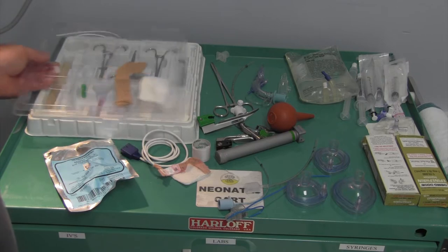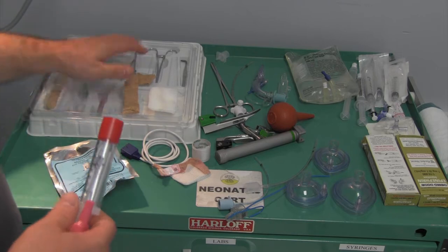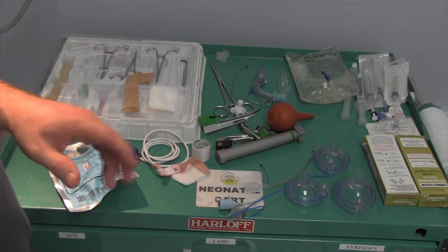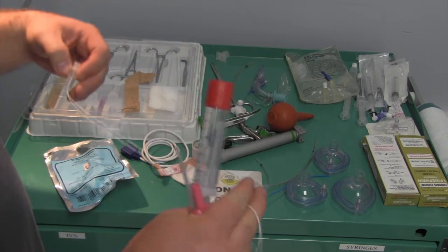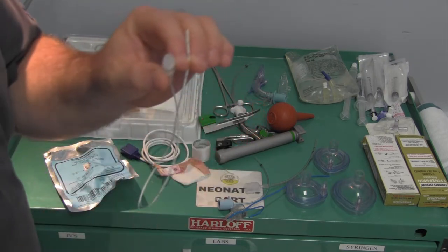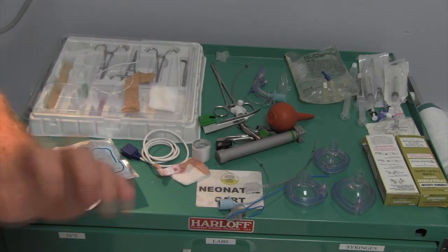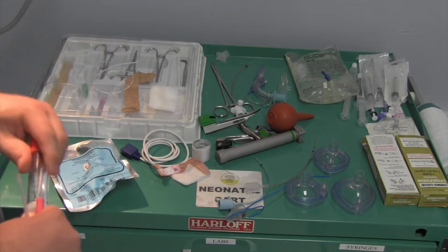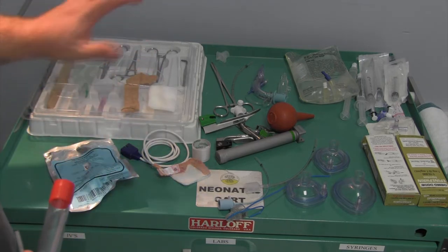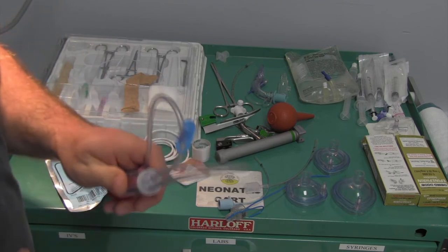This is a quick generic setup for our umbilical line setup. In the case of a resuscitation it's going to be an emergent umbilical line. As I like to say, it's essentially like putting in a Foley catheter - that's about the technique. This is not a sterile procedure by any stretch of the imagination, it's a clean procedure. You need it in a pinch and then it can be re-secured or changed when you get back to the NICU after the resuscitation.